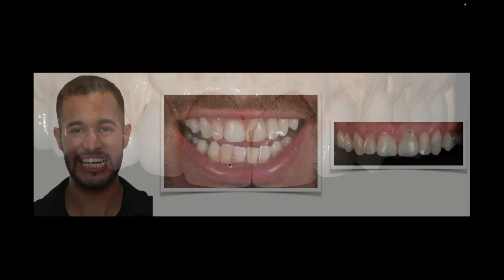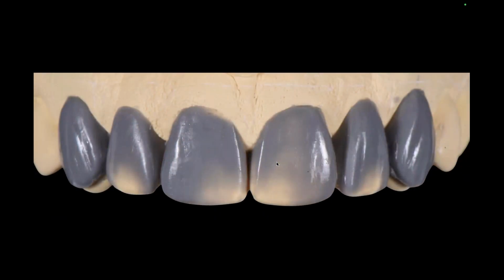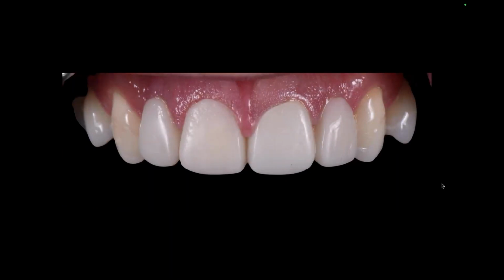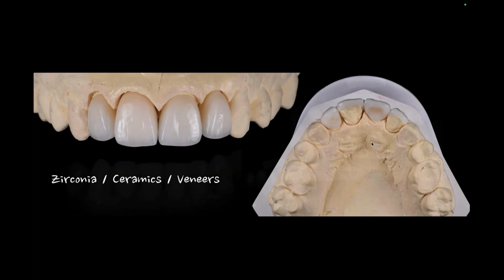So I get a lot of these cases where you can see right away that I have a few nice color teeth and a few bad color teeth. And it's really challenging for me to figure out how to work with them. And I shy away from monolithics in these areas because I know they're just going to create more problems for me down the road, especially when I have a nice looking coloration and all these gray or orangey hues underneath with lots more space. So for me, these are the kind of cases that even if I'm going to use zirconia or lithium disilicate, I'm really going to want to layer something. I want to control as much as I can in the layering materials.